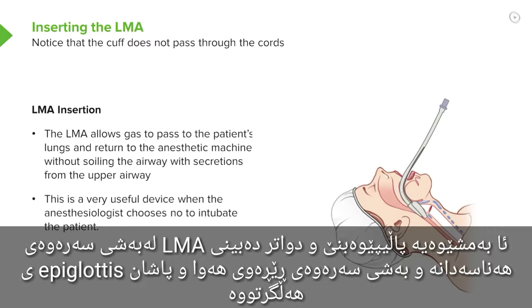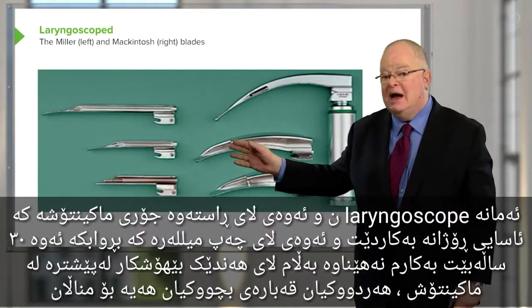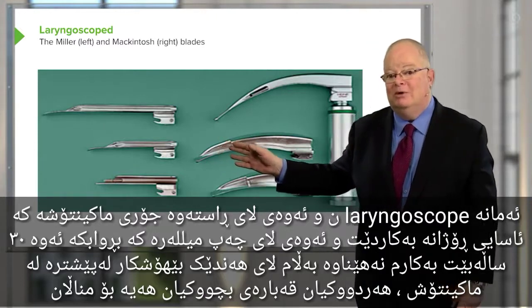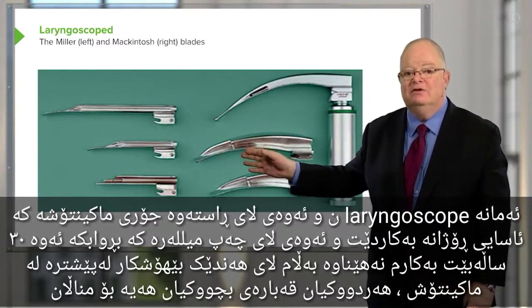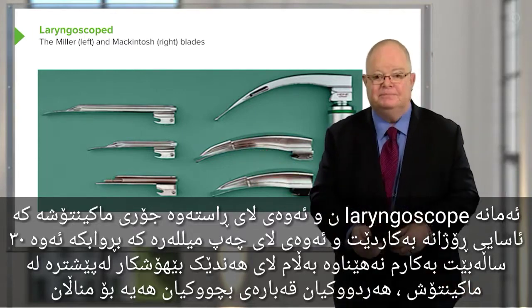It's very useful. These are standard laryngoscope blades. The blade on the right is a Macintosh blade. Most of us use the Macintosh blade pretty much routinely. The blades on the left are the Miller blade. I can tell you I haven't used a Miller blade in probably 30 years, but there are some anesthesiologists who swear by it and use it in preference to the Macintosh blade.